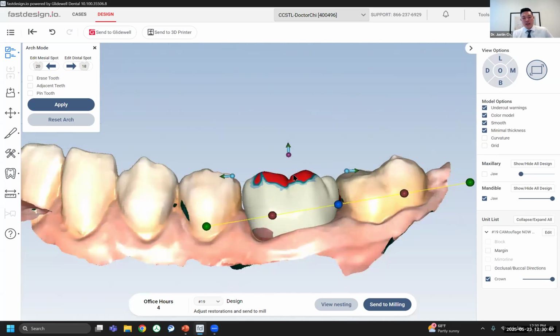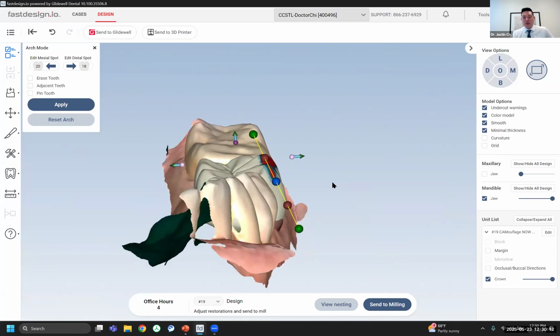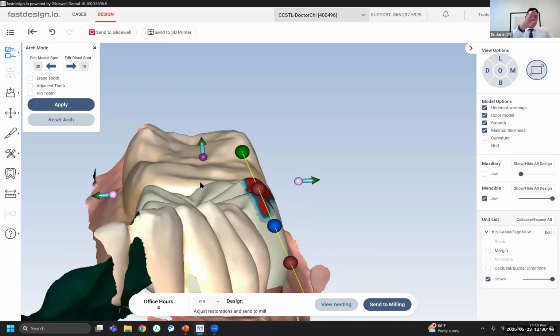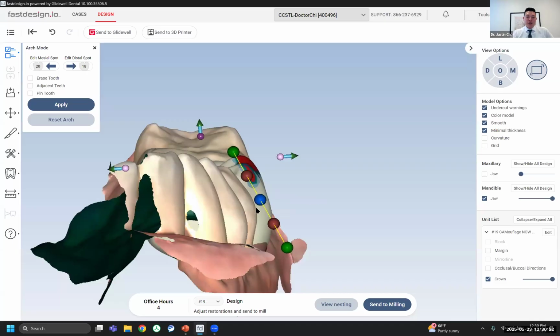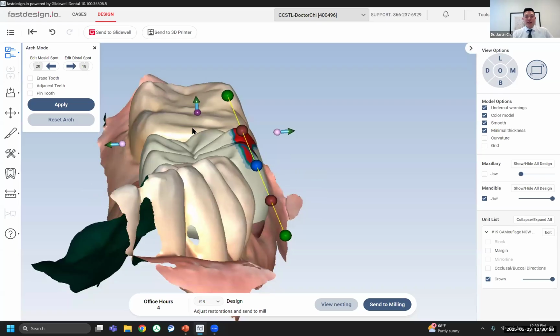Another plane that you really need to consider will be from the mesial or distal. From this mesial view, we're looking at, does this long axis angle match the adjacent teeth? We can use the buccal surfaces of the adjacent teeth as a point of reference, also the occlusal table of the neighboring teeth. Does this look in harmony with those teeth? You can see the adjustment using that same occlusal sphere.